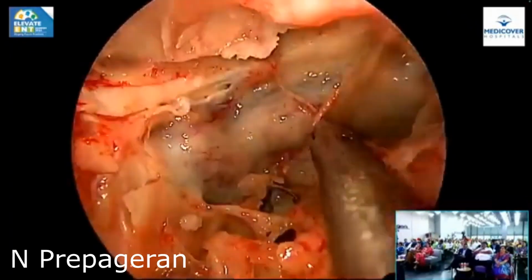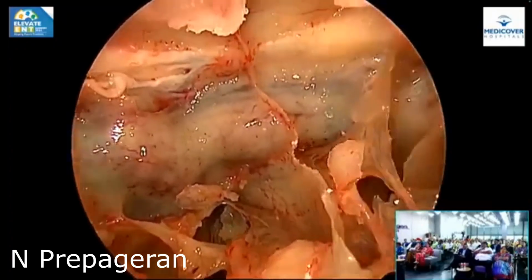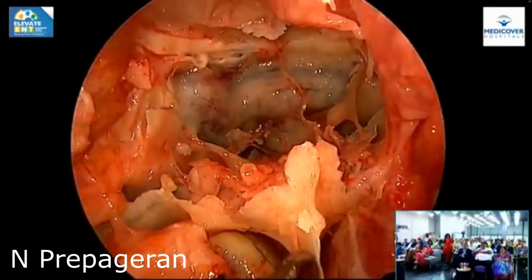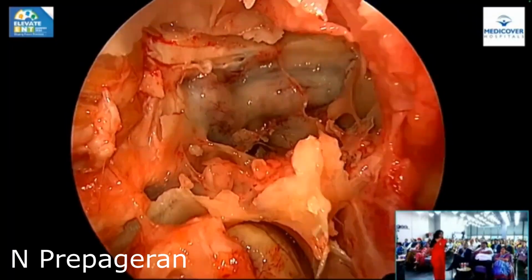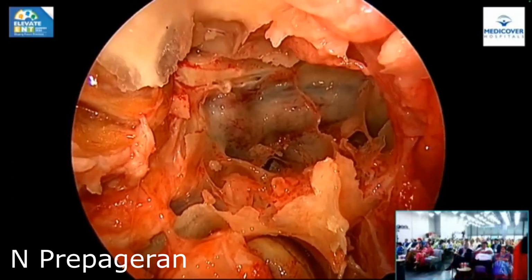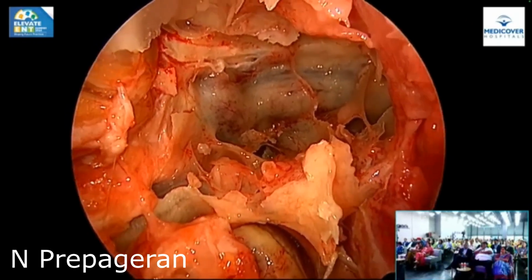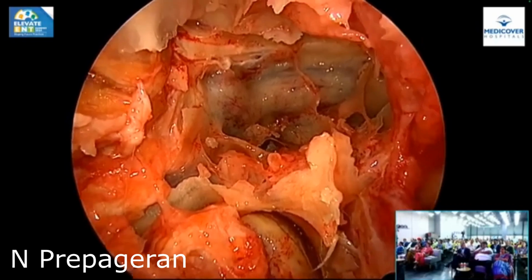So I'm now going to open the skull base. Meanwhile, can you just reorient the audience once again? All the landmarks, please. Sure. Just give me 1 minute. I'll just remove the keel first, and then we are good to go.